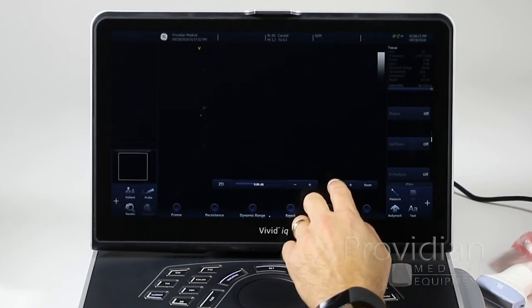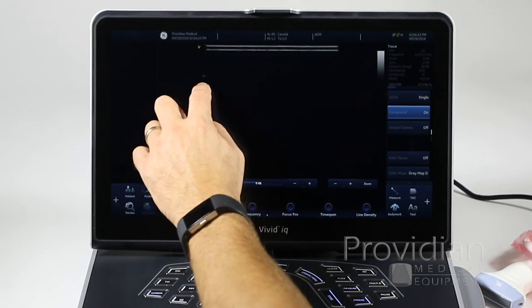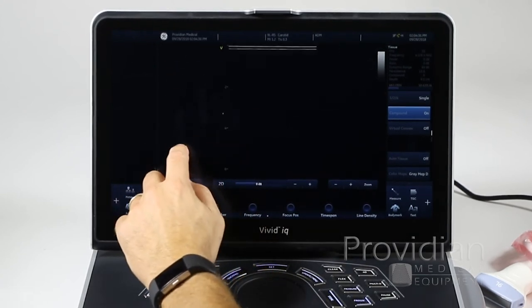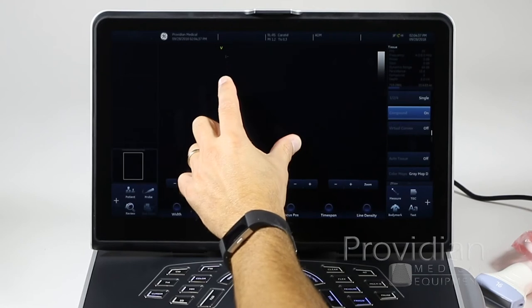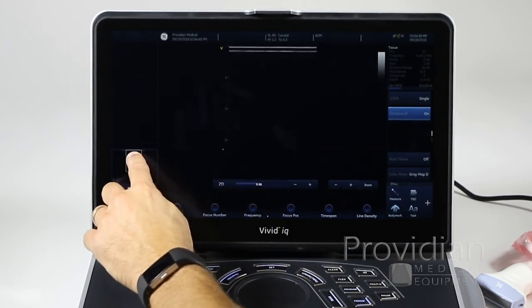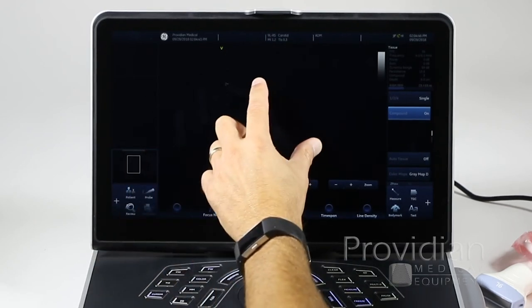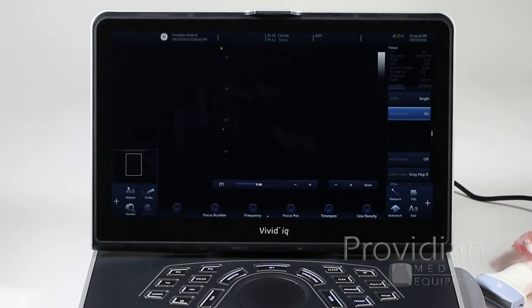Up here we have more touchscreen controls. This is the gain for 2D — you can increase or decrease it. Same thing with zoom. You can adjust depth by swiping up and down on the main image area, zoom by pinching, and there's a zoom box you can slide around to set your region of interest — zoom in and zoom out. You can use all these gestures to get around the screen.